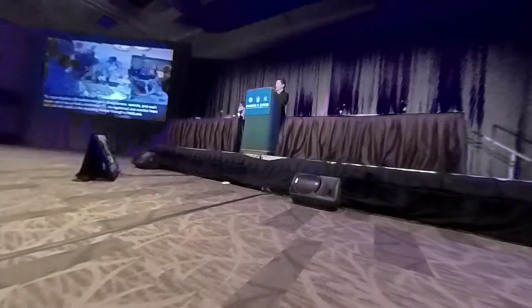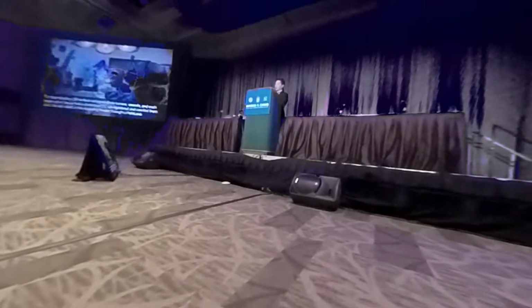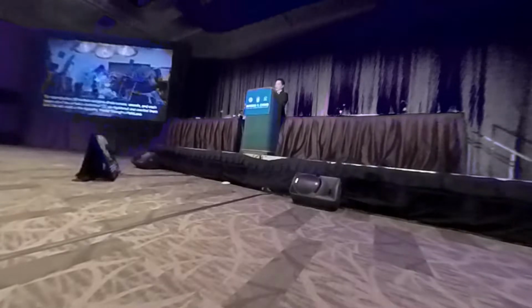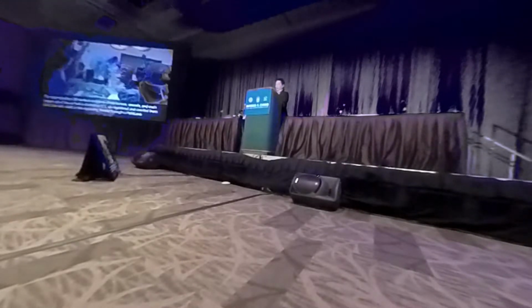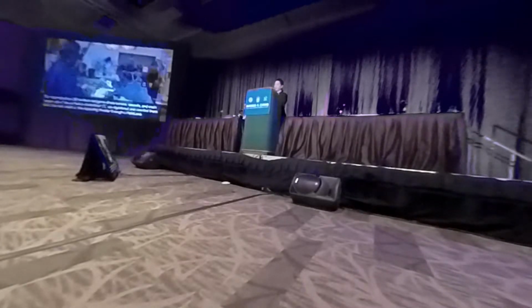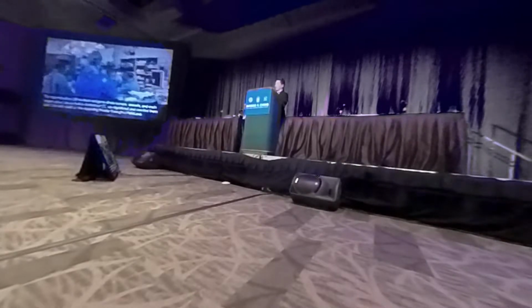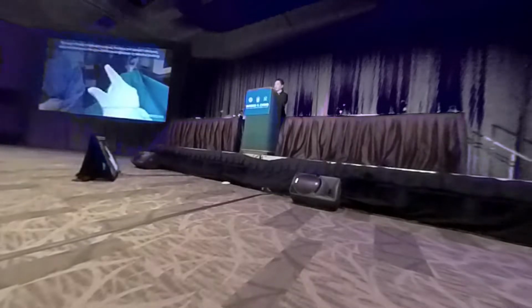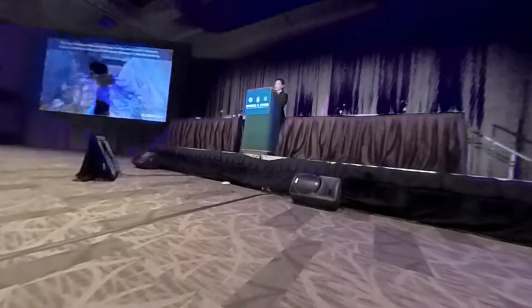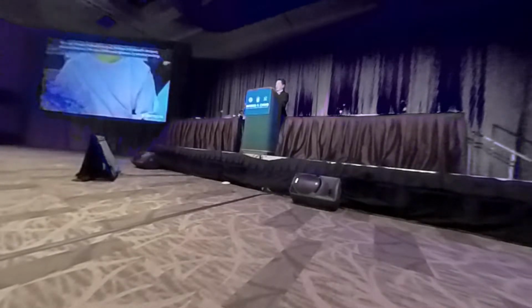So we can put this data into our operative room. By reconstructing 3D surface polygons of the tumor, vessels and each organ out of the patient's abdominal CT, we registered and overlaid them onto the real world in the operative theater through a HoloLens under sterilized conditions. The exact location between surgical devices and patient anatomy could be tracked on a pair of mixed reality smart glasses by sterile tracking.